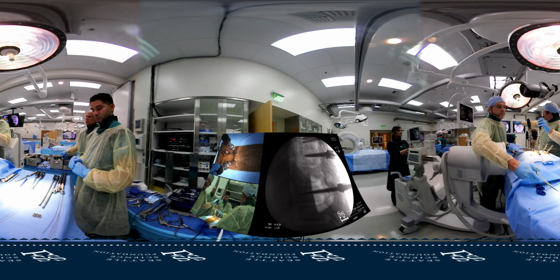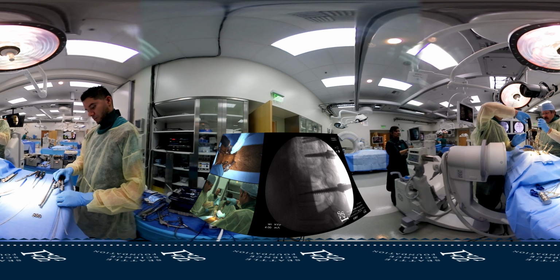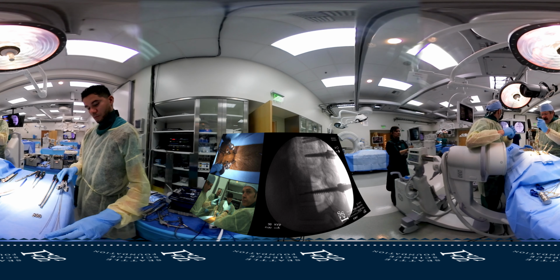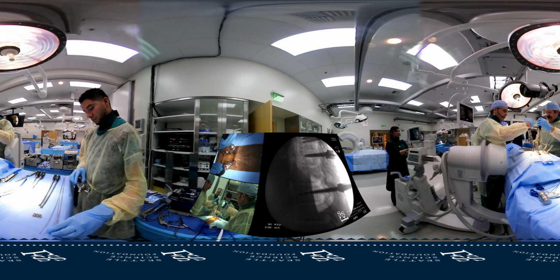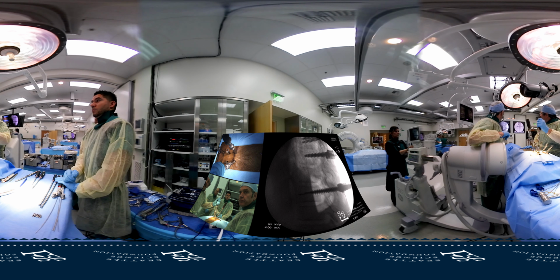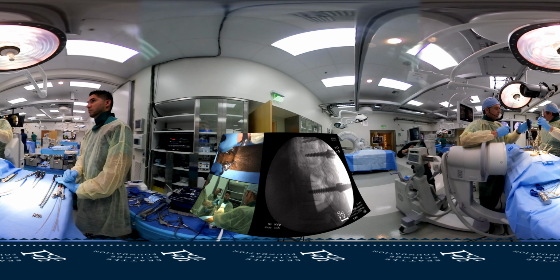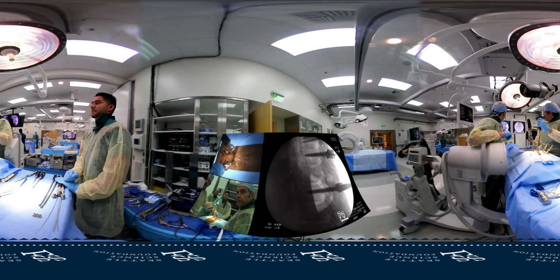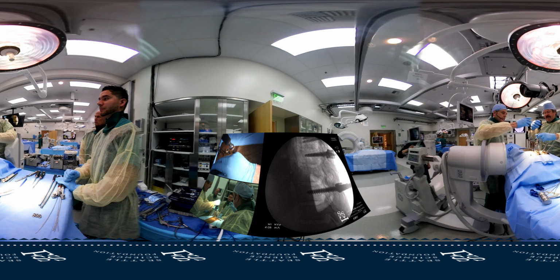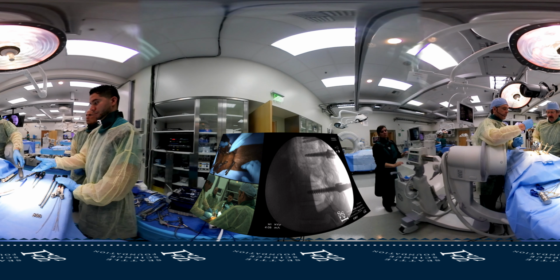And if you look at our screws above, I want to get the depth of our screw to match the screw above, so that when I pass my rod, I'm not trying to change the depth of one vertebral body relative to the one below. Picture. Put them in just a bit more. Picture. If you jam them in too hard, if you put them too deep, you'll block the tulip head from going. So you don't want them bound too deep, and then we'll go ahead and take that out.